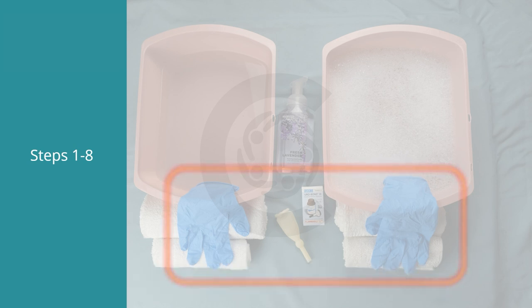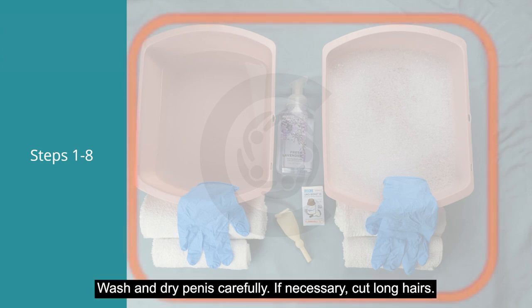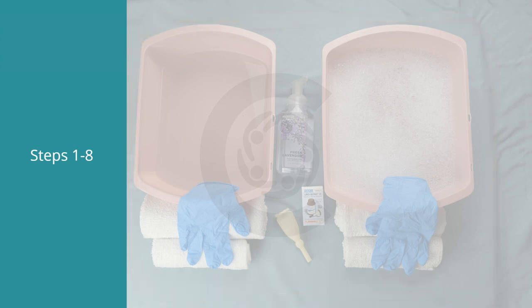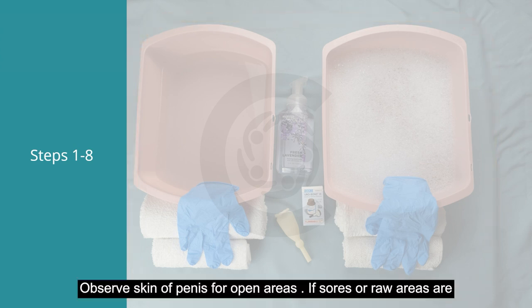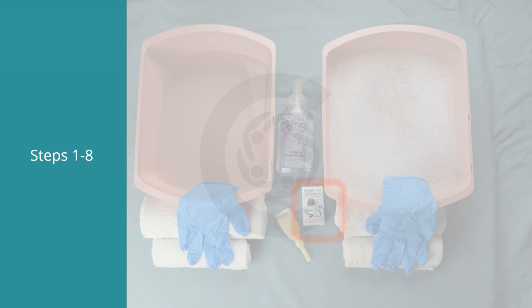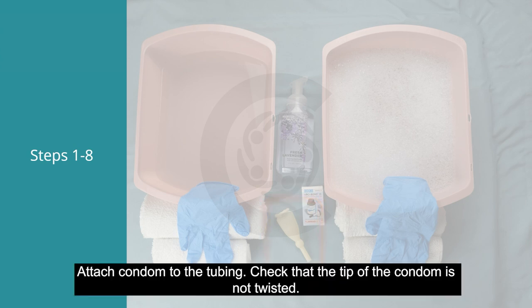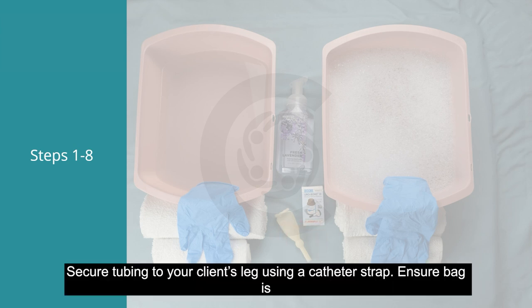Put on your gloves. Uncover the genital area only, wash and dry the penis carefully, and if necessary cut long hairs. Observe and scan the penis for open areas — if sores or raw areas are present, do not apply the condom. Apply skin adhesive at the base of the penis, gently roll the condom catheter over the penis area, attach the condom to the tubing, and check that the tip is not twisted.